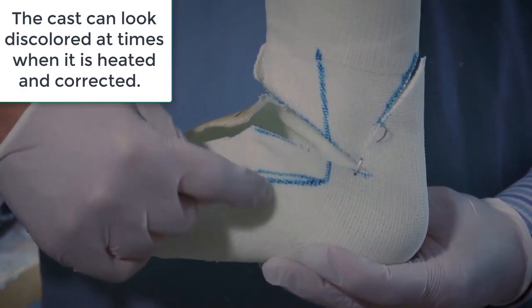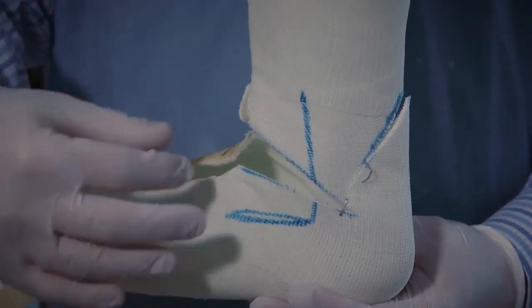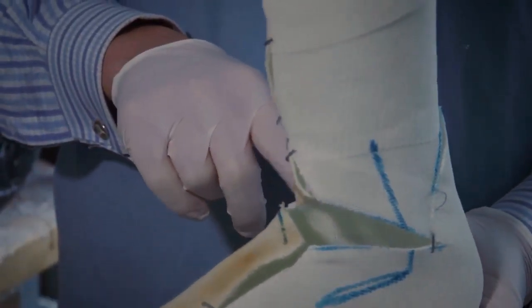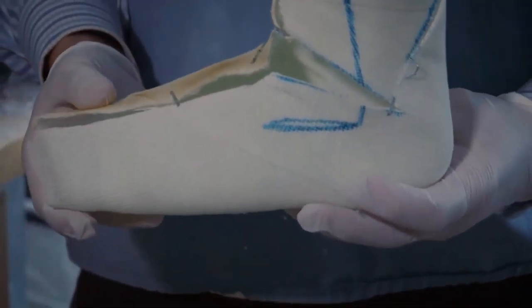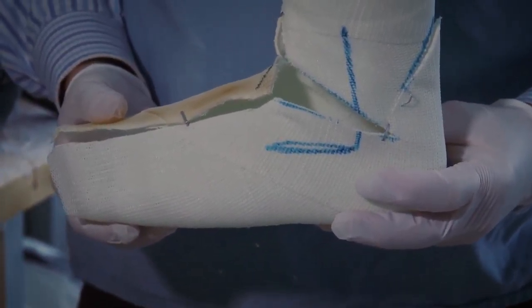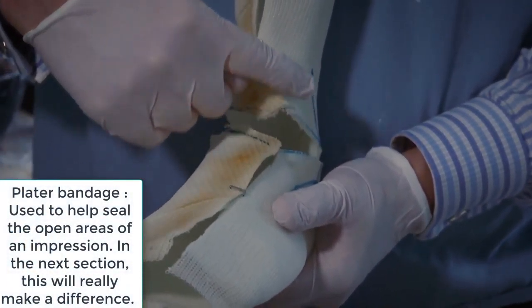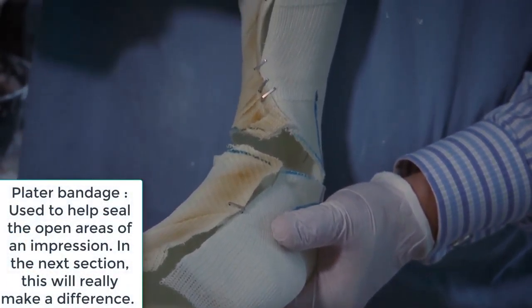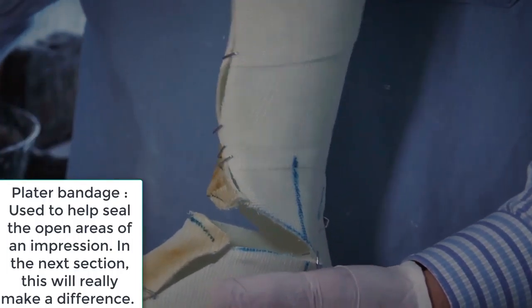Now, if we poured plaster into here without taking care of the holes, that would be a bad idea. So we're going to wrap up this area right here with a plaster bandage and it'll become solidified. Up here we're going to put a strip as well, because we don't want fluid pouring out of the mold.